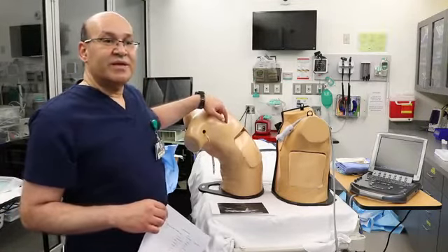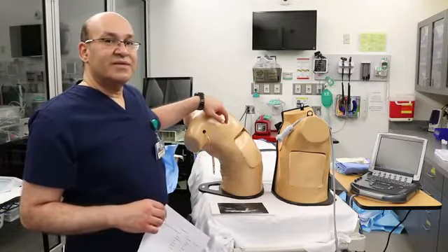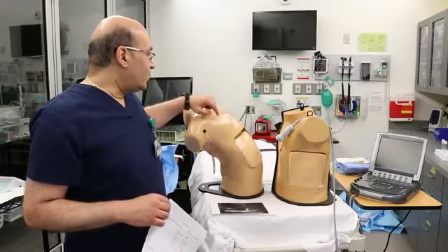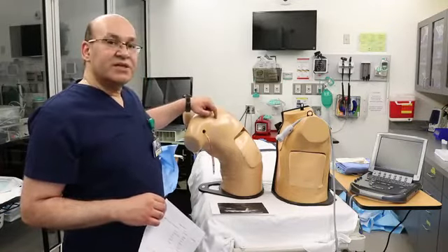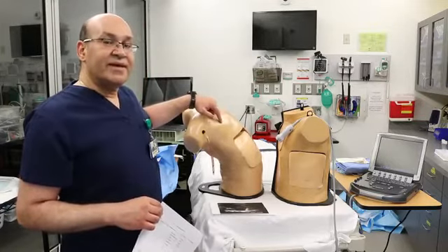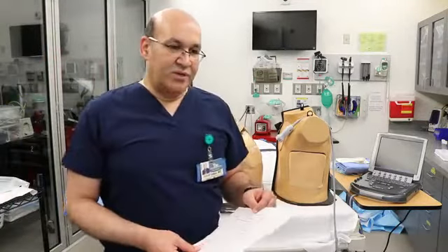This is a requirement. So if you are doing a procedure that has 2 sides, you don't skip the side that you want to do and do it on the opposite side, and you need to mark the side on the chest, back of the chest, and put your initials and date of the day. So this is how you do the timeout.